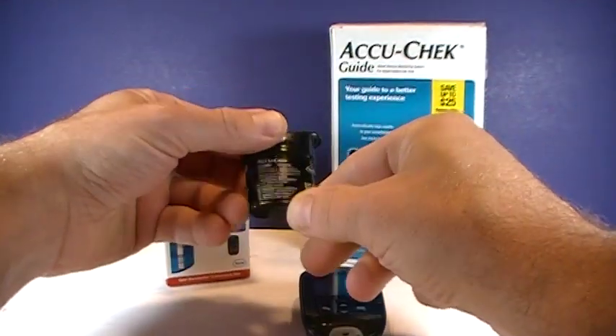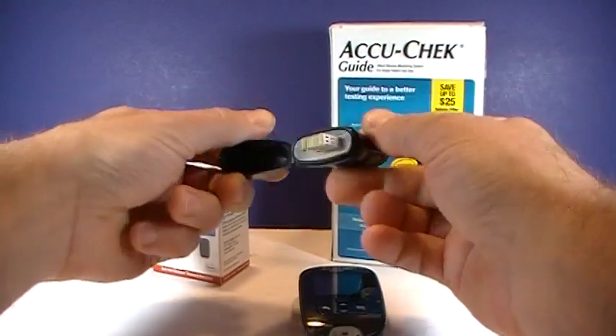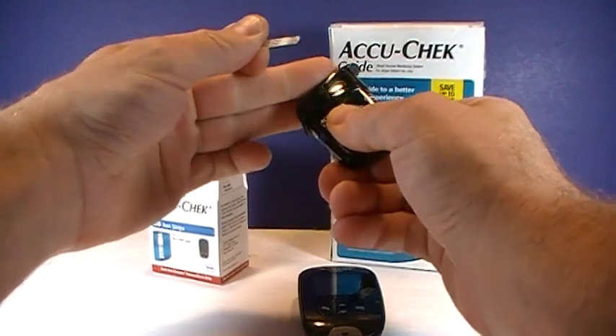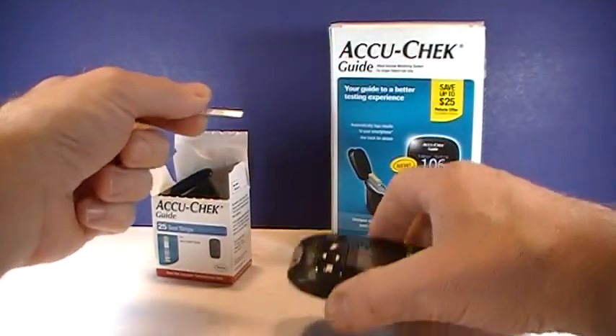I really like the holder for the test strips because it's designed so they don't fall out. You just go ahead and remove one. You always want to be certain that you close that lid tightly, as exposure to air can reduce the accuracy of test strips.